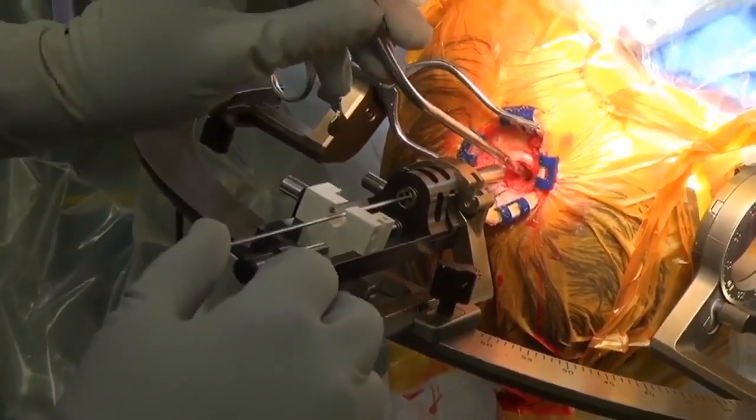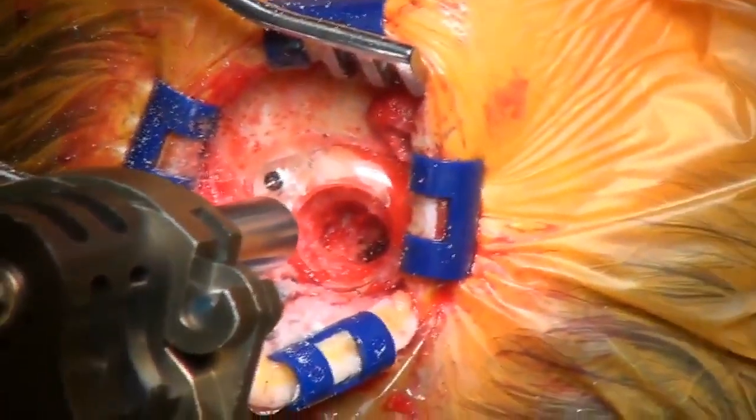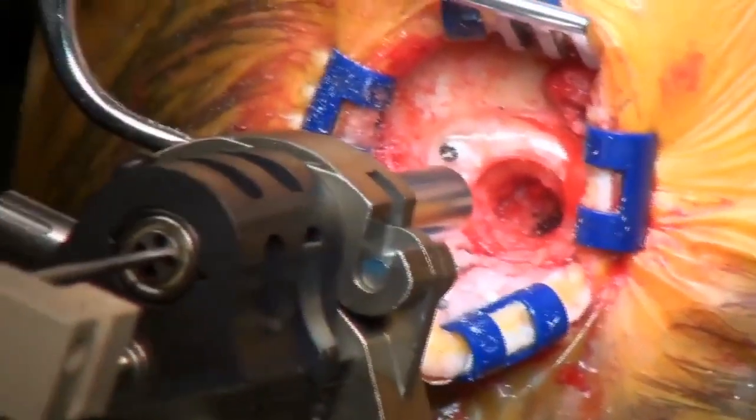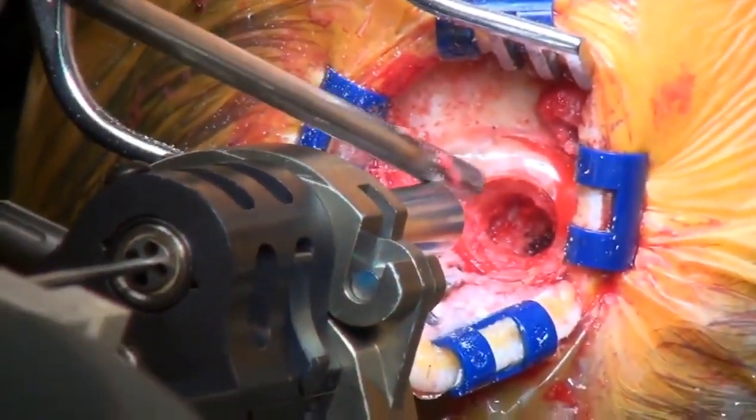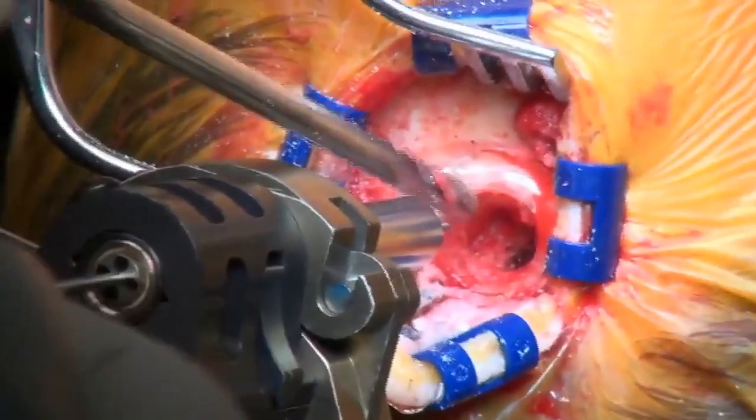So far, what we're looking at at the bottom of our skull here, a little hole, is called the dura mater, and that's the nice white envelope that contains the brain and all the spinal fluid. So we may see a little bit of spinal fluid when we do this.